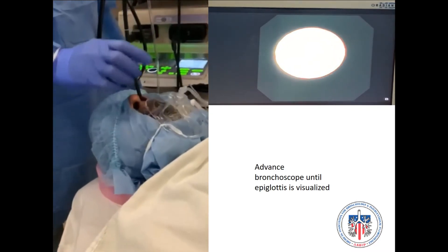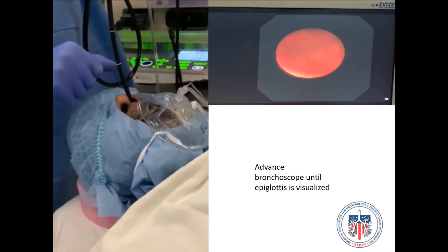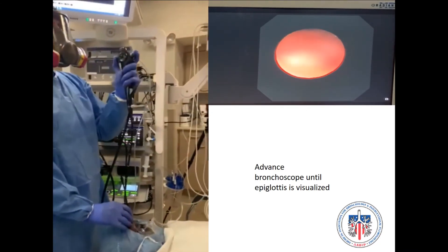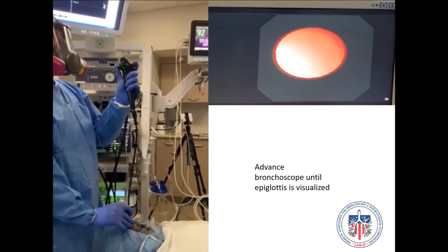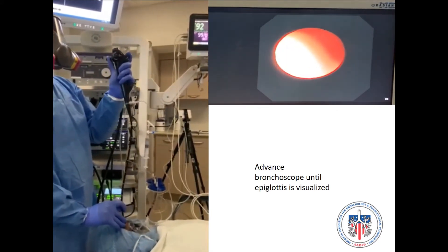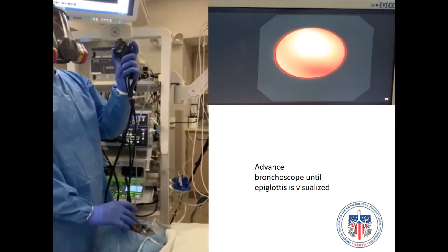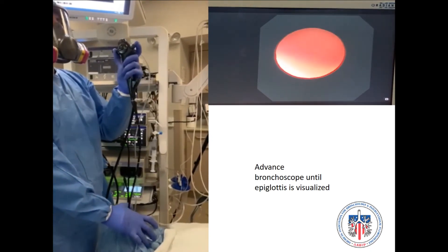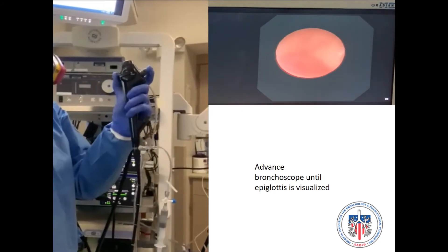During this part, suction can be applied to allow better visualization of the anatomical structures. A jaw thrust maneuver, as seen in the video performed with the same hand holding the bronchoscope, could also help to allow better visualization of the epiglottis.